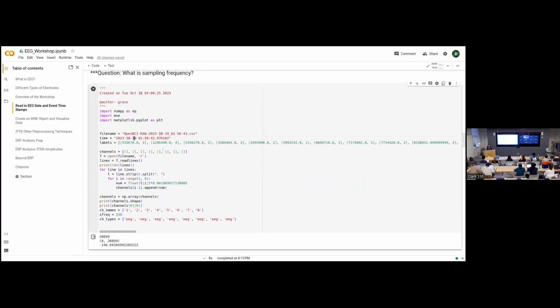These lines down below have the file name and the time when this data was recorded. Notice this variable called labels. It records the timestamp structure like a list where there are 100 items. The first sub-item in every item is the milliseconds at which a card was shown.